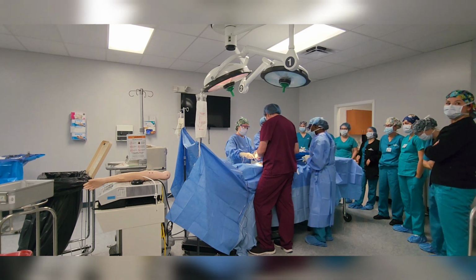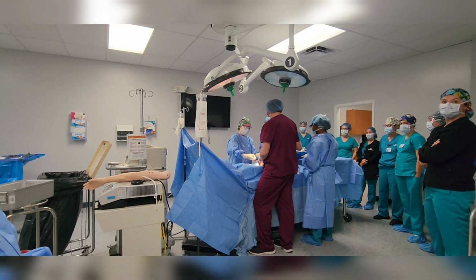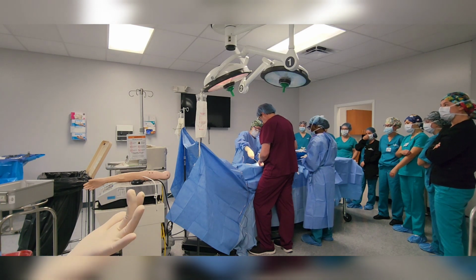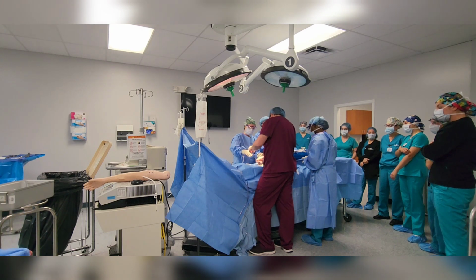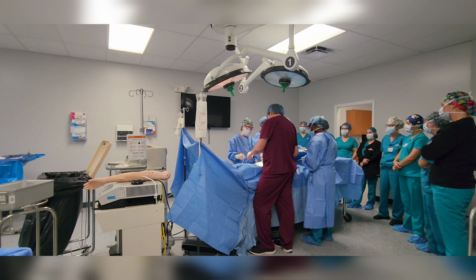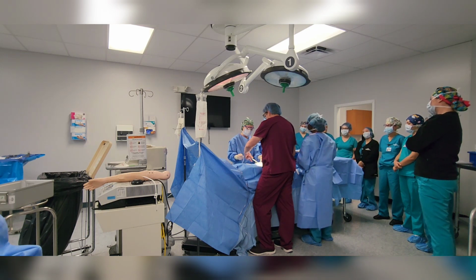Okay, hold that one. Alice. Take that off. How do you take them off? Yeah, you kind of do this, and you're just kind of pinching up on it like this. I can rotate it. If you're like this, you're just trying to take it off, just take it off like that.